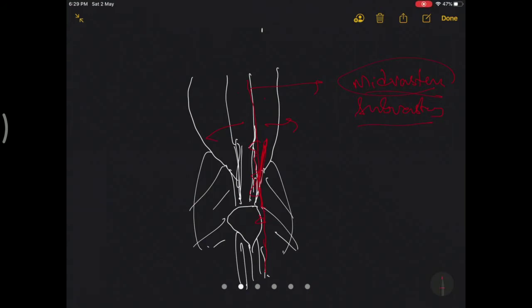And some people even went ahead and said we will not touch the entire quadriceps mechanism, and they started approaching through the subvastus manner. That is, leaving the quadriceps entirely untouched and dissecting through the medial retinaculum and the medial intermuscular septum, keeping the whole of the quadriceps untouched.